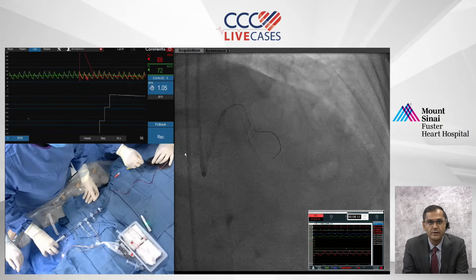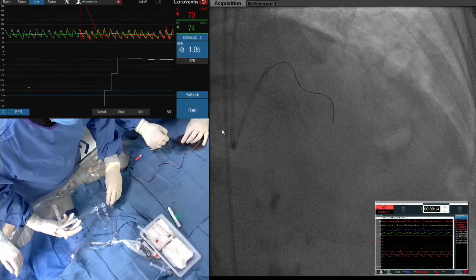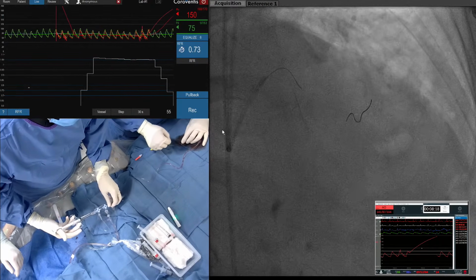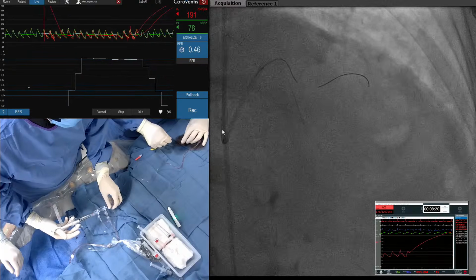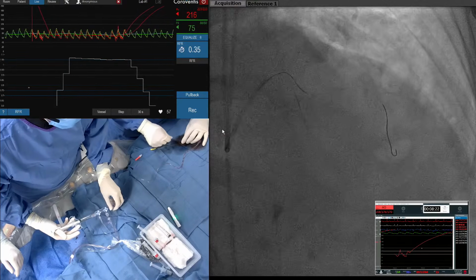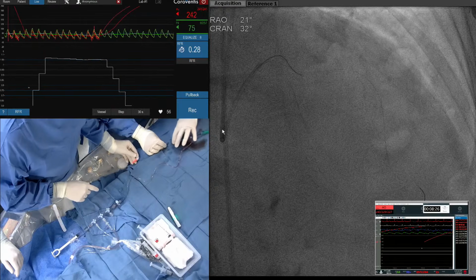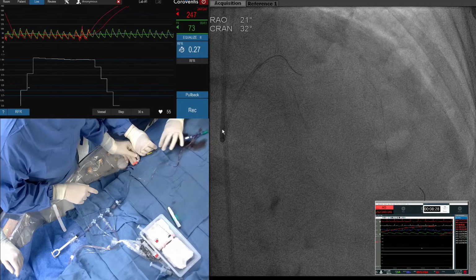There we go. Okay. Now that's septal. Better. Yeah, that's septal. There you go. Wow, big tortuosity. Good. All right, so we're done with the run-through wire. Very easy to go compared to the other wire.